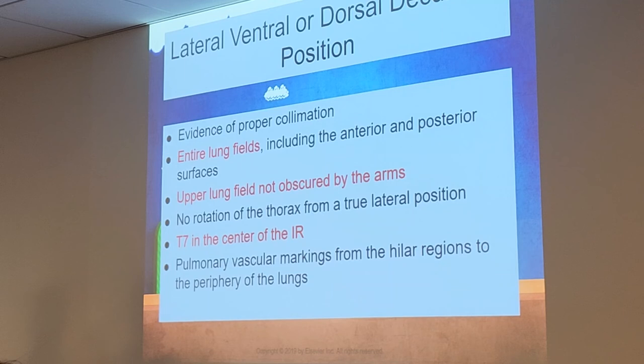Yes, question? When you're saying evaluation, is that what we actually need to check on? So when we say evaluation, this is what the radiograph needs to demonstrate before we send it to the doctor. It's called evaluation criteria. As a technologist, we must check all these points. So you're going to take your x-ray, it comes up on your computer screen, and you should be running through all this in your mind: do I have all the criteria to send this to the radiologist? Yes.